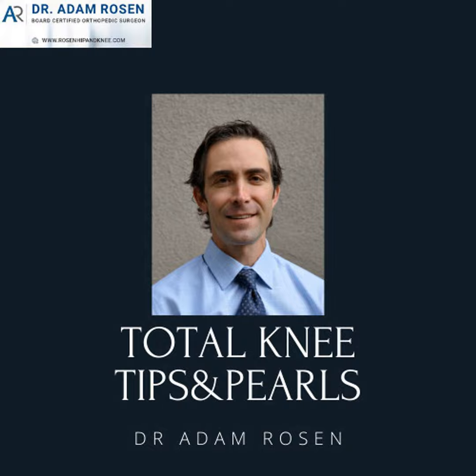And if it's not, is it implant on implant? Is it implant on anatomic? Is it anatomic on anatomic? And why and where? Are there things that I can remove? Are there things that I can change?